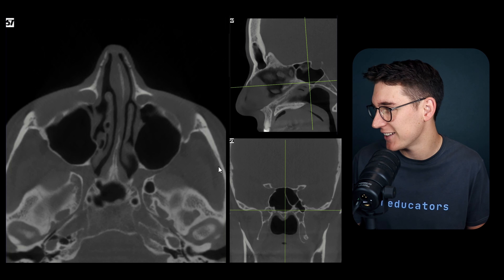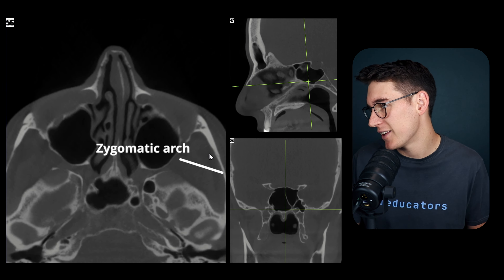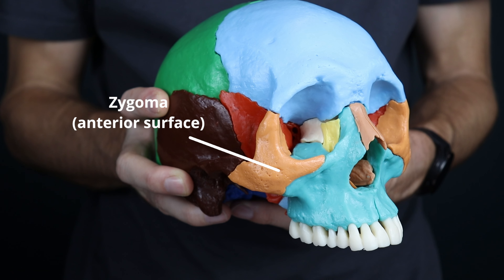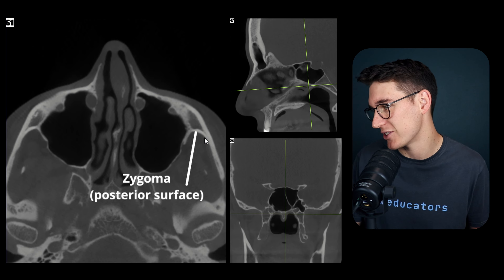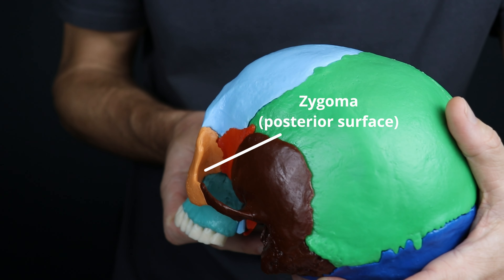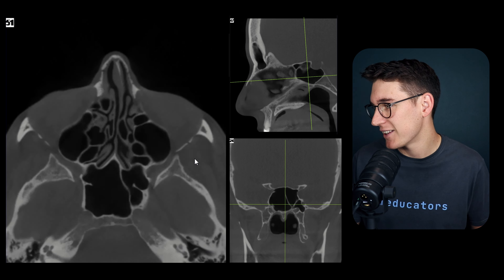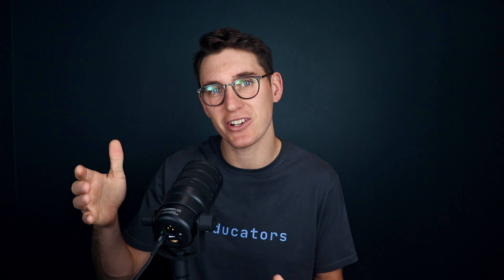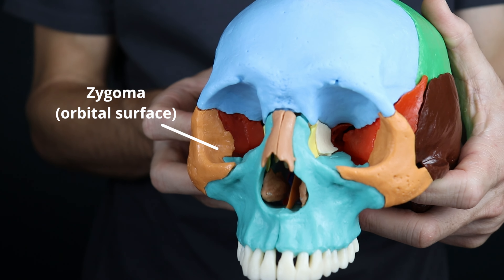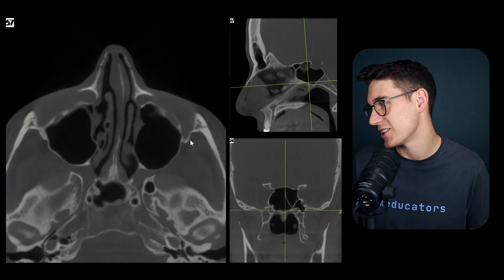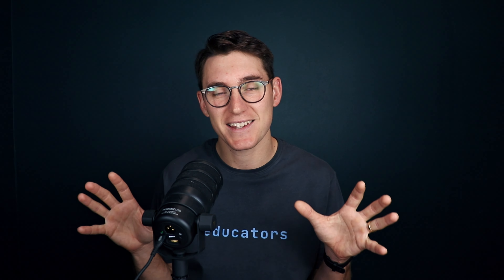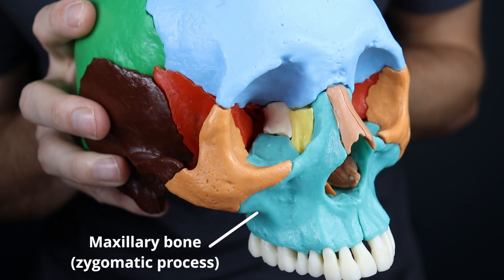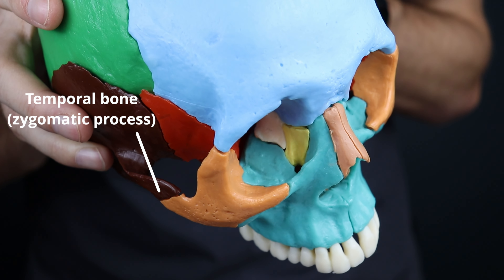Here's the zygomatic arch on our axial slice. The zygoma has an anterior surface, a posterior surface facing the infratemporal fossa, and an orbital surface making up the majority of the anterolateral part of the orbit - as shown on our 3D model. There are three separate surfaces and three processes extending to the zygoma: the zygomatic process of the frontal bone, the zygomatic process of the maxillary bone, and the zygomatic process of the temporal bone.